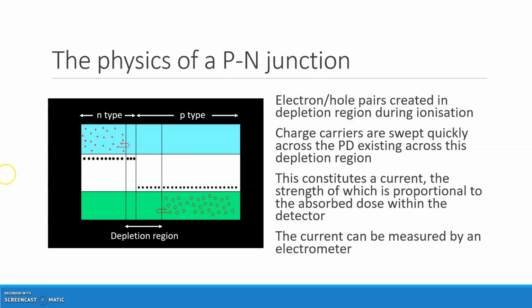And what that does is, and the energy level of those you can see represented by these dots here. And because it's in group 5, that donates electrons to the lattice. Now these electrons are free to move around. They're in the conduction band, that blue part you can see here. That's bonded to a much thicker bit of P-type silicon.